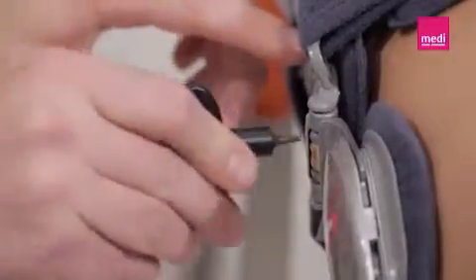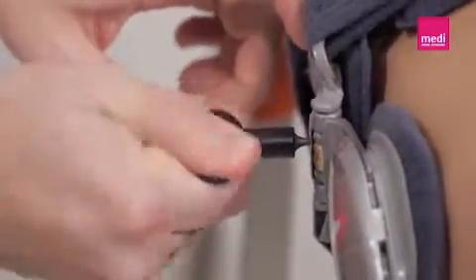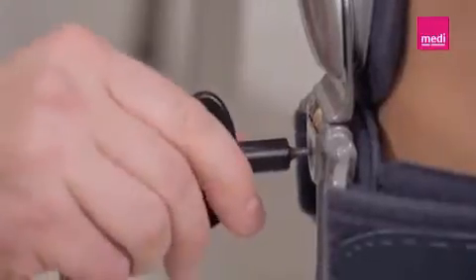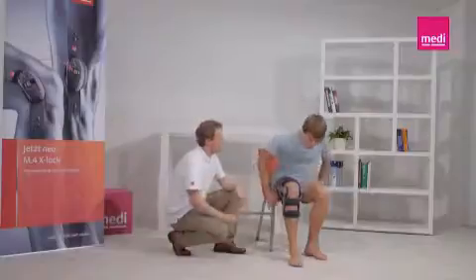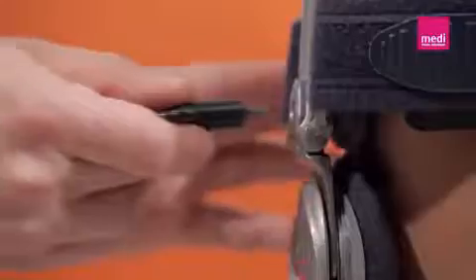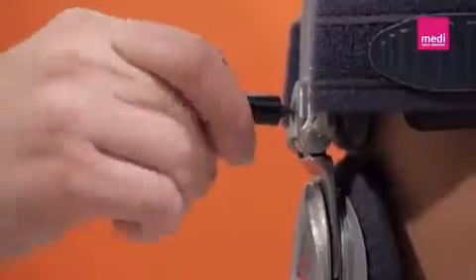With the patient sitting, set the varus valgus hinges to the neutral position with the help of the Allen key. This has been achieved if the pad lies flat on the orthosis hinge, but exerts no or only very gentle pressure at most. With the patient now standing, set the force by turning both adjusting screws 1/4 of a turn. This setting is a good starting point when wearing the brace for the first time.